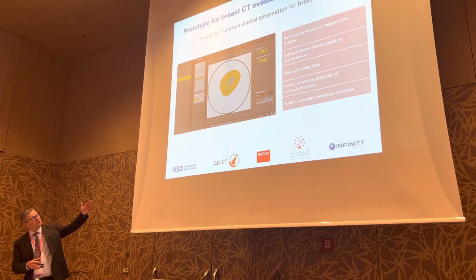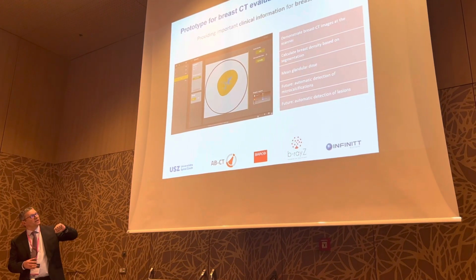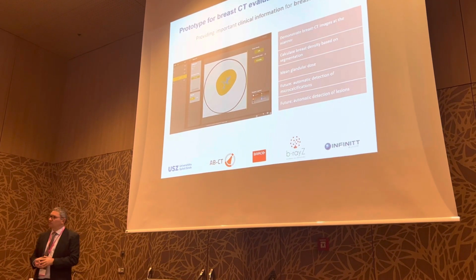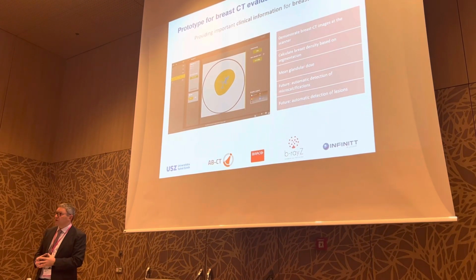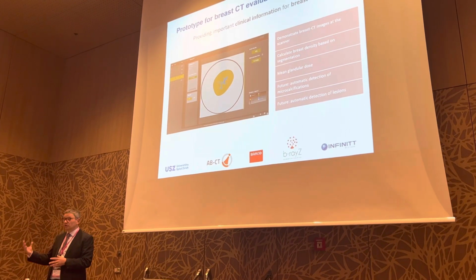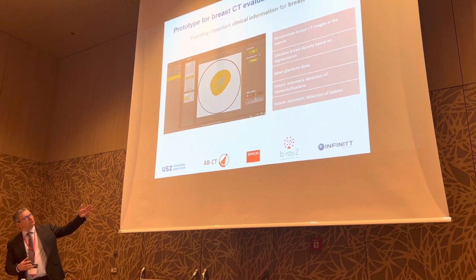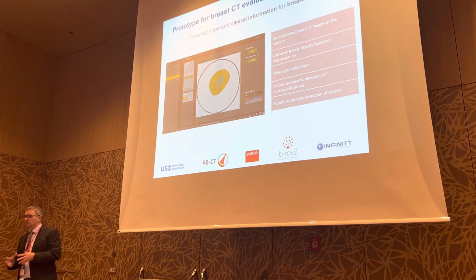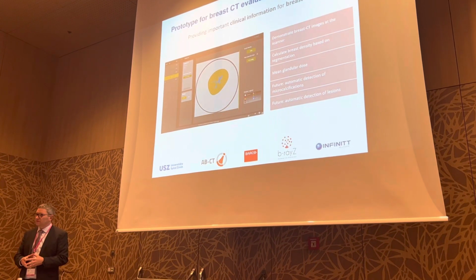From this segmentation, it gives you a computation of the mean glandular dose, and it also gives you a percentage of glandularity or breast density. In the future, we will also have modules for tumor detection, and it also visualizes the breast CT, which is helpful if you want to look at the images directly at the CT scan.